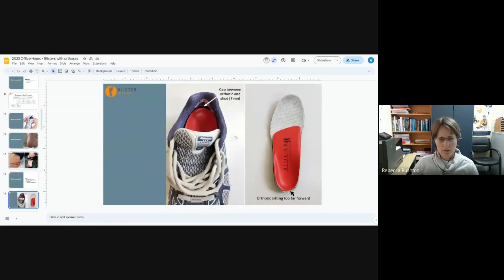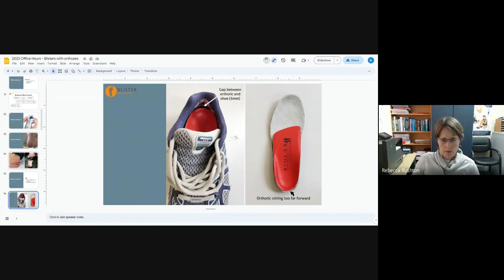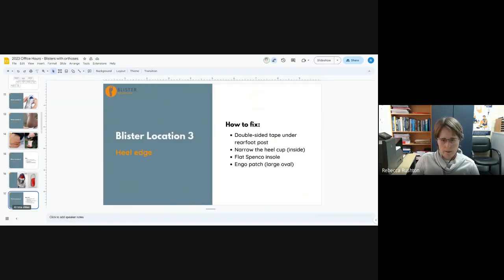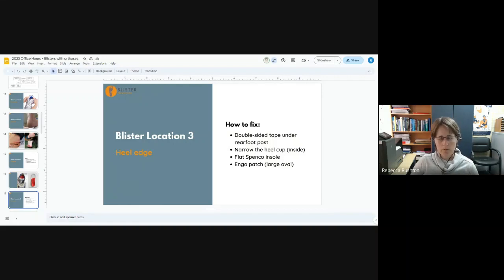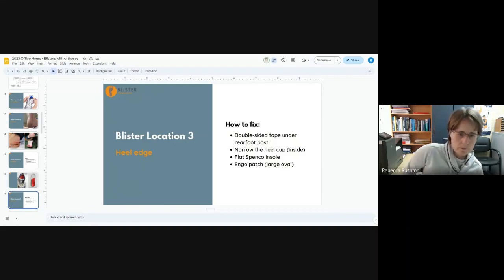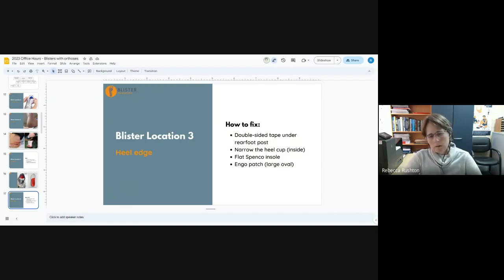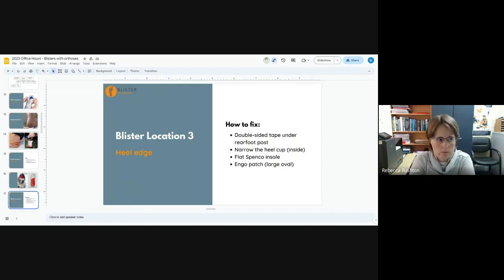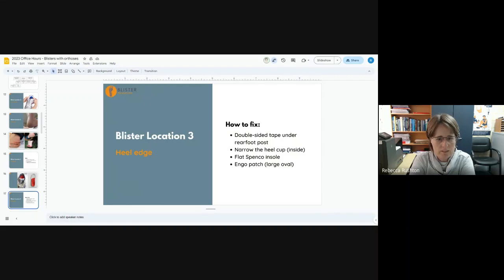Here's a picture of the orthotic sitting forward. Really the only way to fix this is to use some double sided tape under the rear foot post of the orthotic. I guess you could give them a new insole, like a Spenco insole underneath, if there really is a decent divot and you just can't avoid the orthotic slipping forward.